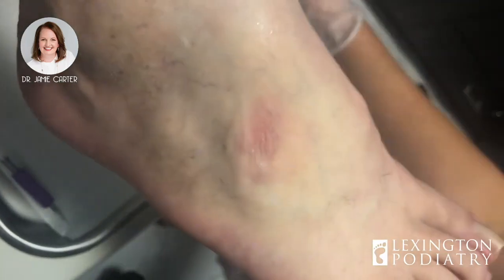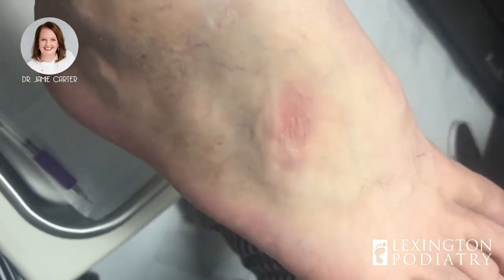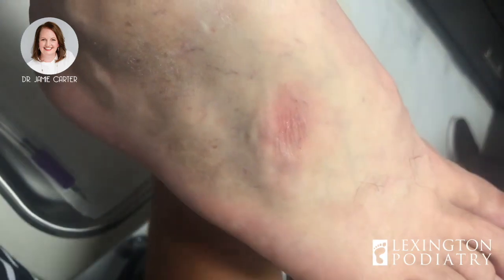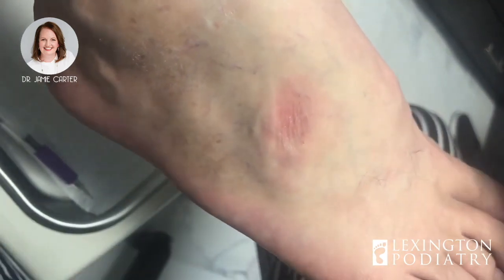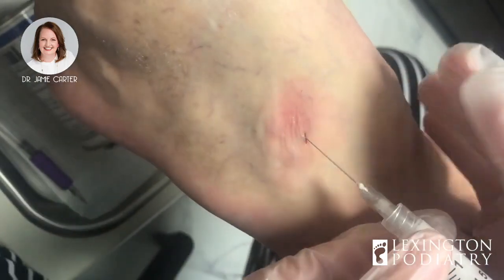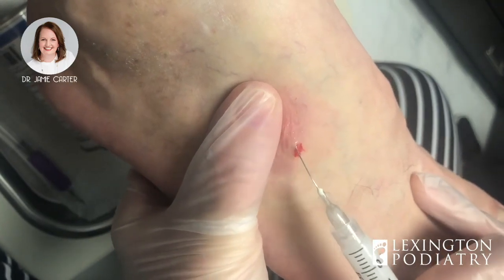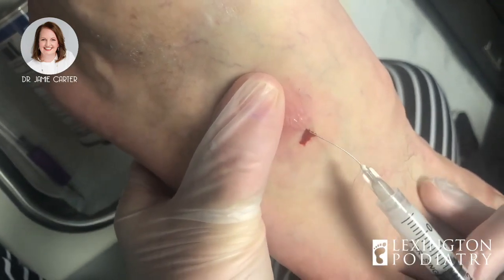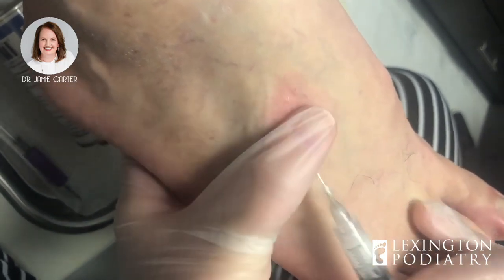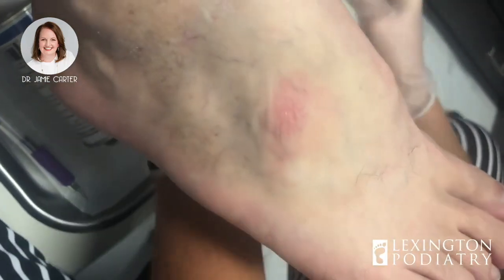Sometimes people are sore the next day — I've squeezed on you quite a bit. Think about popping a zit on your face; it does get sore. Okay, now we're going to clean it off and do a little bit of a steroid injection. Are you allergic to any numbing medicines or steroids? Just a little bit more cold spray. I tried to go back through that same little hole — this is going to make that area puff up a little bit, but the steroid will help to shrink it all the way. There you go, you did great. Band-aid.